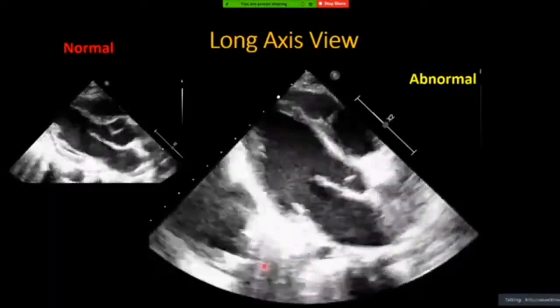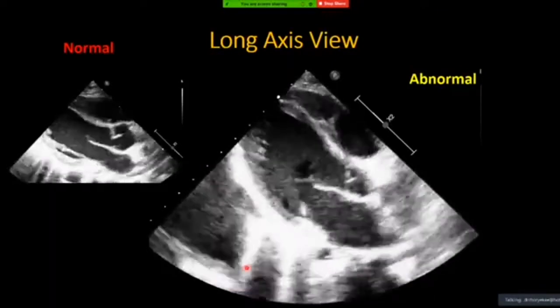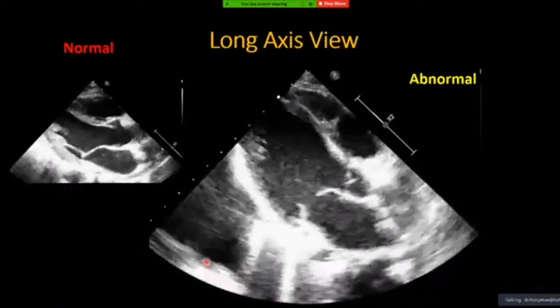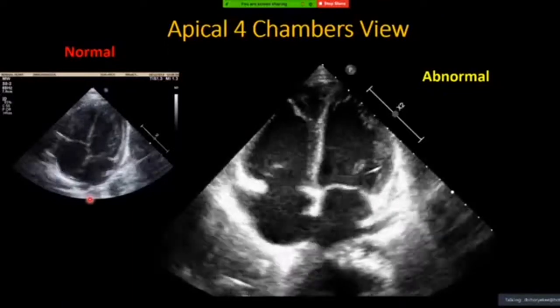Very importantly, we pointed out that this is an effusion. When you look at it carefully, this is some of the consolidated lung. Okay, so there's movement in and out, in and out. Yeah. So this is a 4-chamber view. Okay.